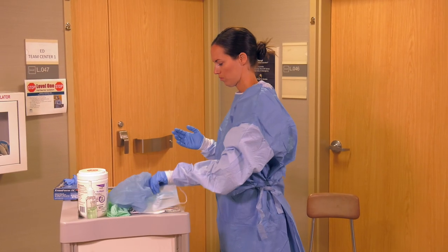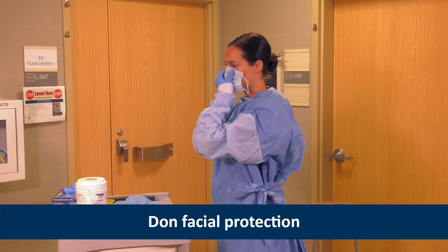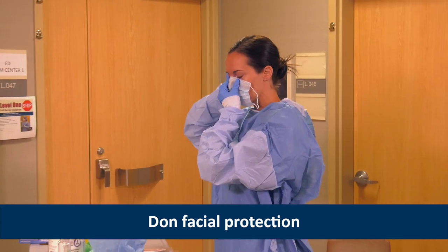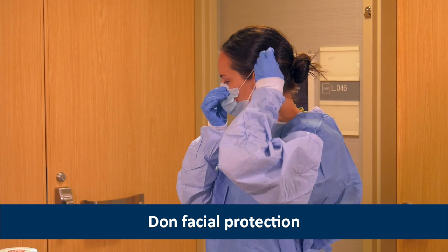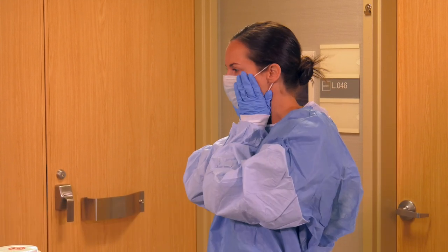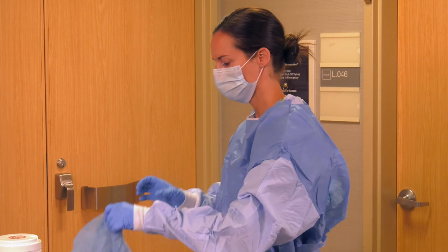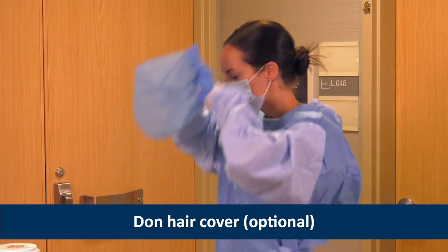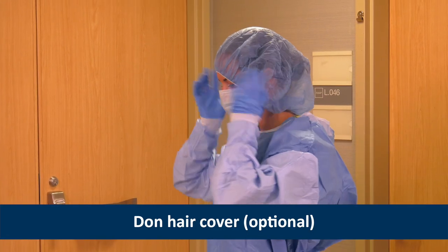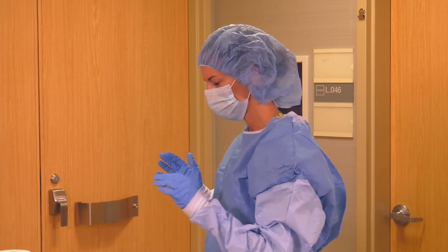Next, Heather chooses the appropriate facial protection. She puts on a surgical face mask since it can be used in place of a respirator for clinically stable persons under investigation for VHF. If her patient has a respiratory HCID, Heather would don an N95 respirator, or a powered air purifying respirator, also known as a PAPR. Next, Heather puts on a hair cover. It should cover all hair and the ears. This step is optional and should be skipped if using a PAPR.